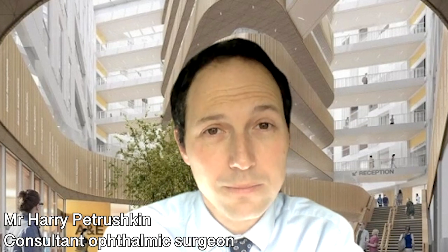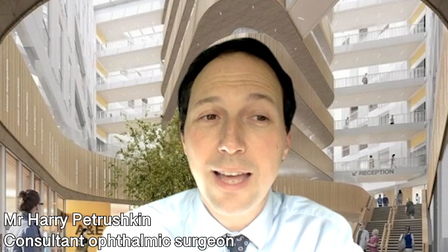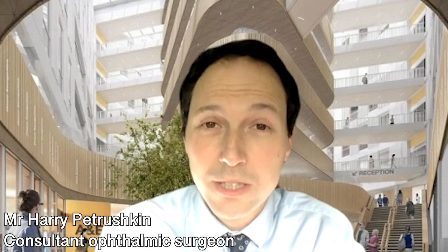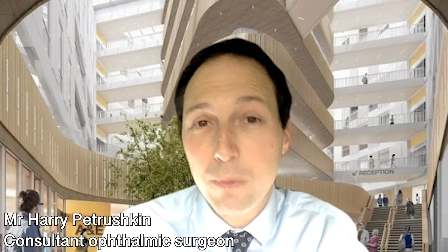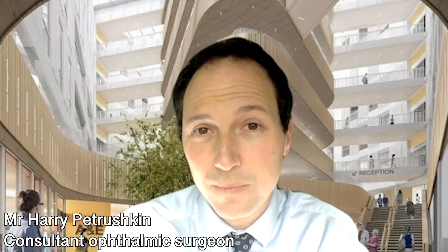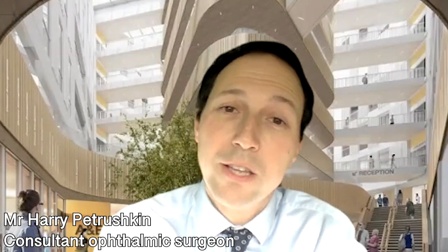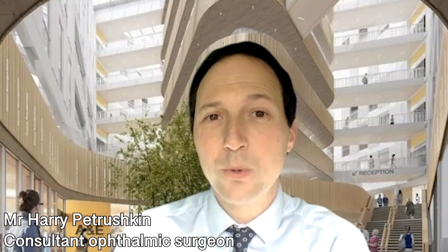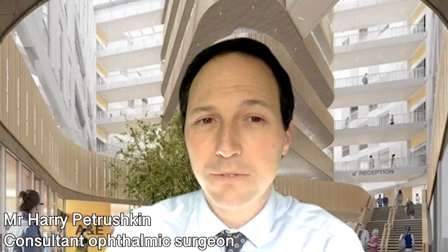It is possible that if you have a multifocal lens implanted and the halos around the light sources bother you so much that you want to have the lens explanted, you need another operation to remove that lens and implant another lens. And that can be a difficult procedure, because if you wait until you get used to the lens, then the lens becomes quite embedded inside the eye. And so we tend to avoid doing that wherever possible. But that is a potential risk of having a multifocal lens.